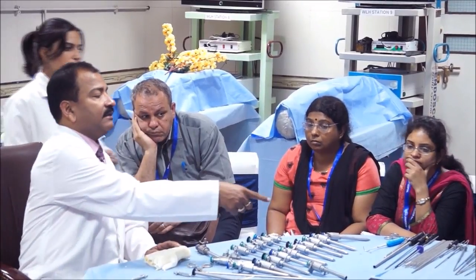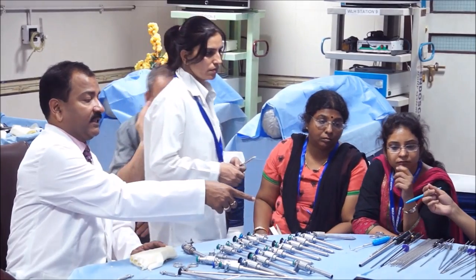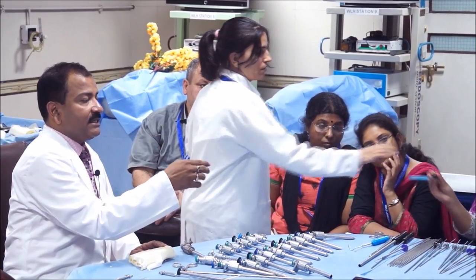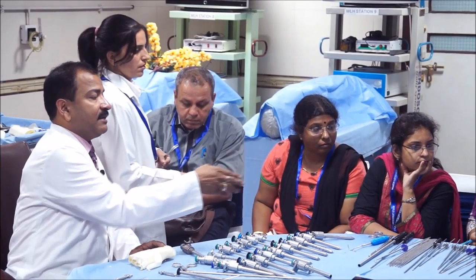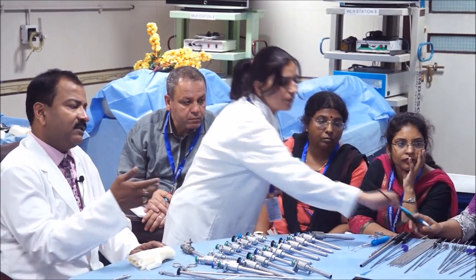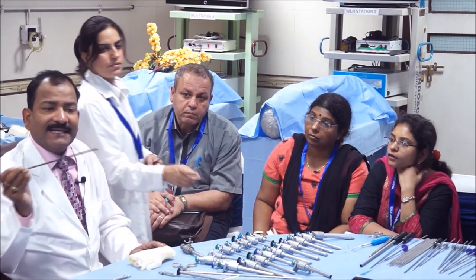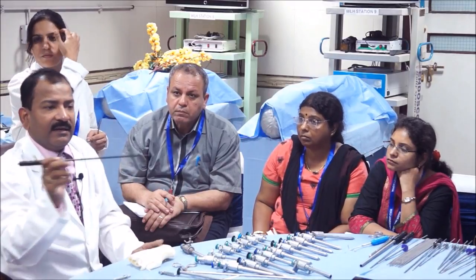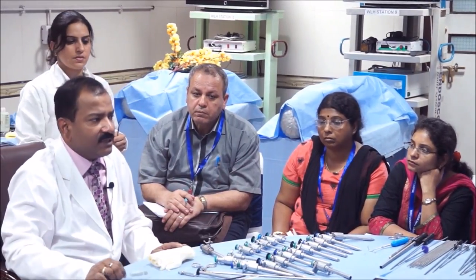This is the aspiration needle here. And it is better for cholecystectomy. Here, this is the aspiration needle. But if you want, you can use the Veress needle also, but the aspiration needle is easy, and here you will attach the suction directly. But if you want you can use it, you are absolutely correct.